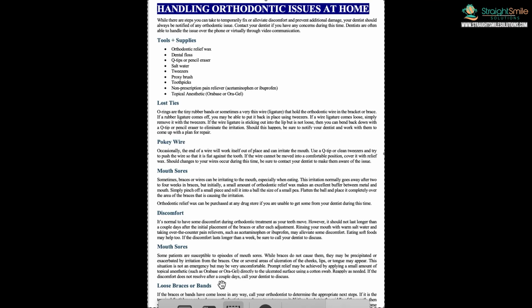If there's broken brackets, I've always made it a requirement that they give me a call so I can schedule a longer time, because obviously regular adjustment appointments are shorter than a bracket-fixing appointment, and it makes everyone run late if they're coming in with broken brackets. A lot of times kids don't tell their parents because they don't want to get in trouble, but it's super important that they do, because otherwise you don't have to fix it if they didn't let you know. You can reschedule it for another time, which is going to be inconvenient for them, but it's only fair to all the patients that are running on time that you run on time. So it's just a matter of how you explain that.